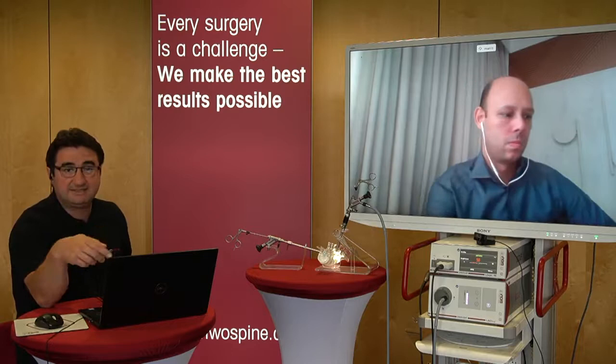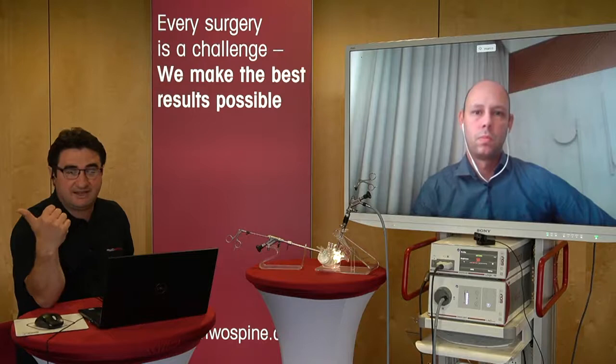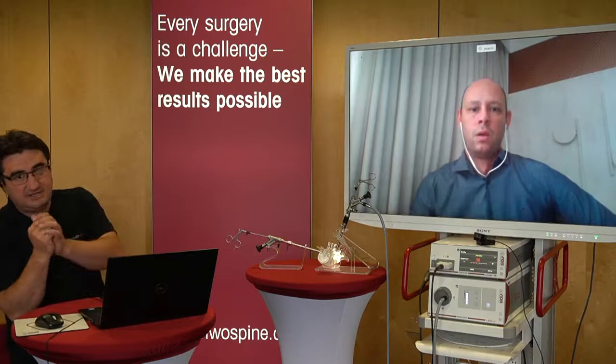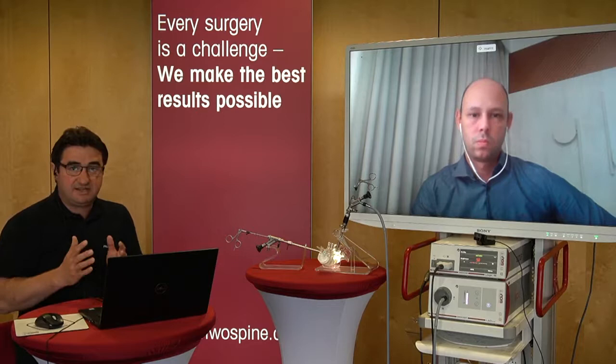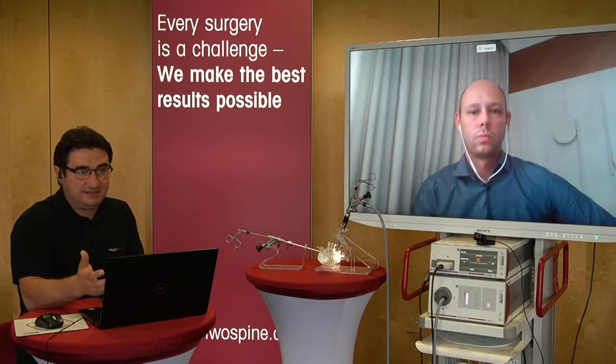As we talked about in the previous question, if you choose the transforaminal approach for migrated disc herniations, then you have to do something more to go straight. You have to go to the cranial side or caudal side. Then you will change your direction of the sleeve, and by this way you can easily squeeze the exiting nerve root in the foramen. For example, for caudal migrated disc herniations, there is a restriction from the caudal pedicle. Then what you can do is resect some part of the facet and the pedicle to reach the caudal side. But we are talking about minimally invasive surgery. According to me, it's better to do it in 15 minutes with the interlaminar approach to reach the caudal side. Do you agree with this? Yes, this is the basic for me.